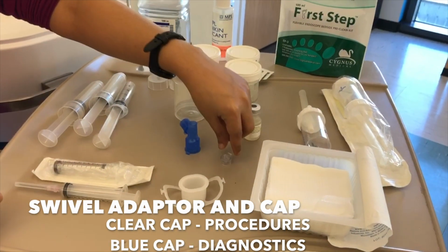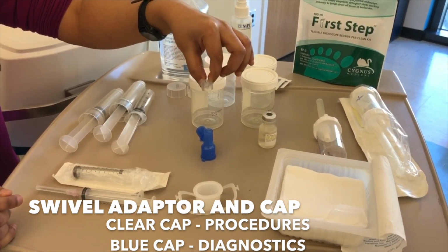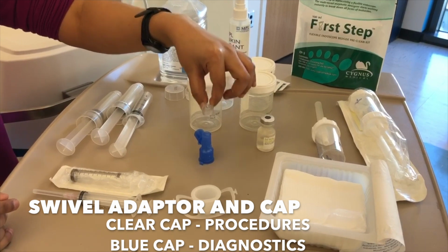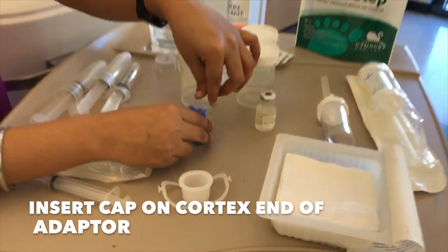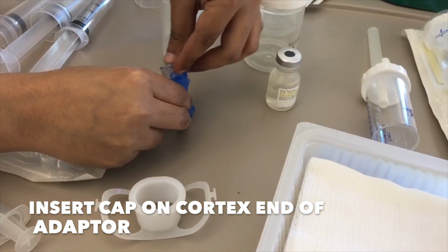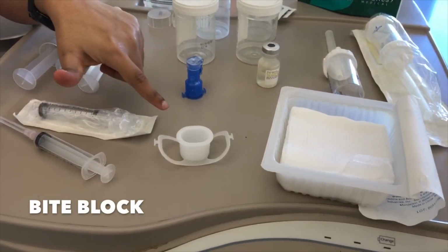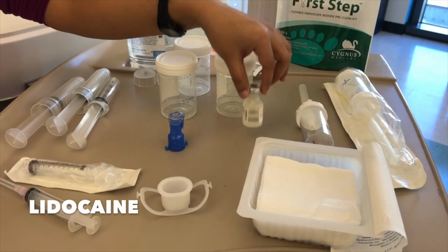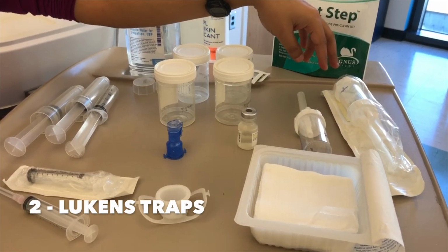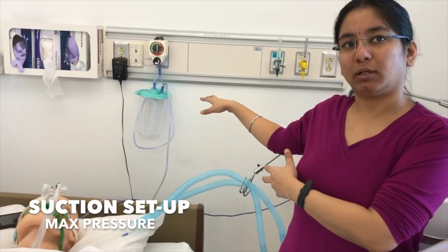swivel adapter with a white cork. This helps in procedural bronchoscopy, and there's a blue cork which helps in diagnostic bronchoscopy, and this goes here. And the bite block to protect the tube and the bronchoscope from biting, the lidocaine drug, two Leukens traps if the physician needs any sample for lavage, and a pack of 4x4. Suction setup should be ready with a max pressure.